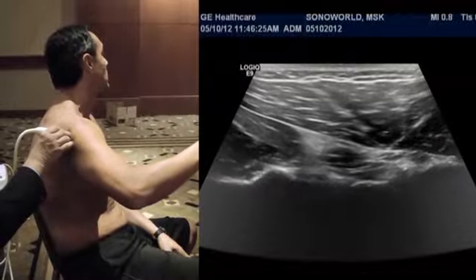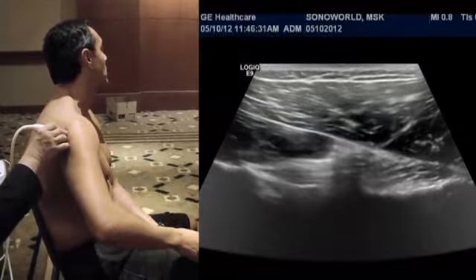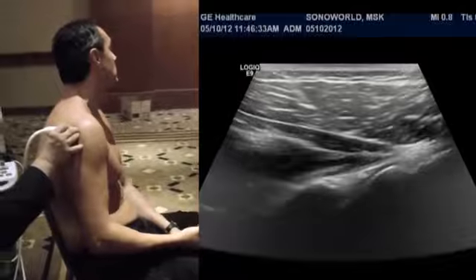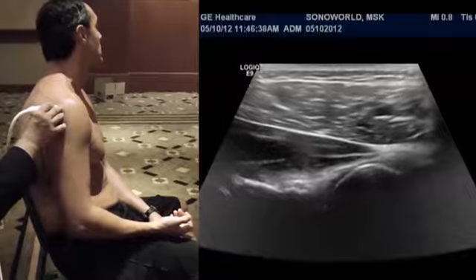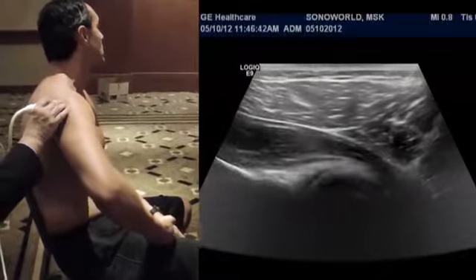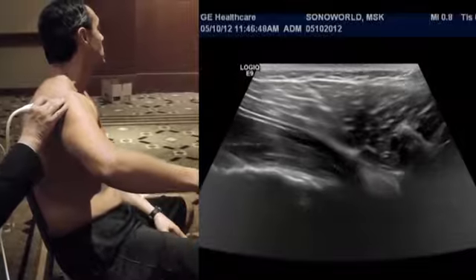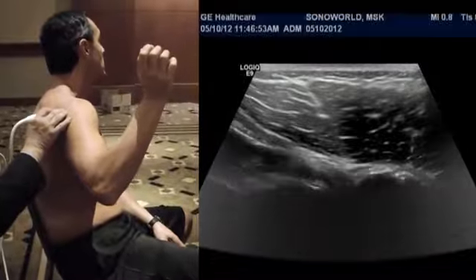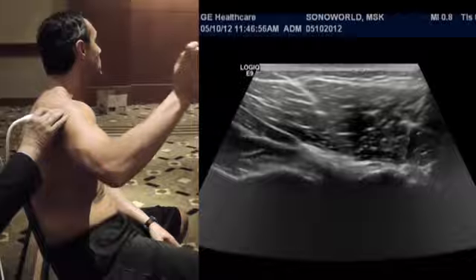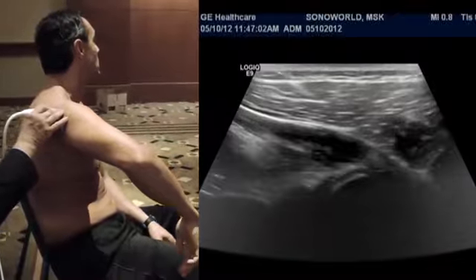First, we're going to start from neutral position. He's going to bring his arm down towards his side and rest his elbow and forearm in the neutral position. In stages, therefore, first we're going to ask him to raise his elbow outwards. Next, we're going to ask him to bring his hand back as if he was throwing a ball. Third, we're going to ask him as he was throwing the ball forward. So those are the three stages that you could look at the individual.